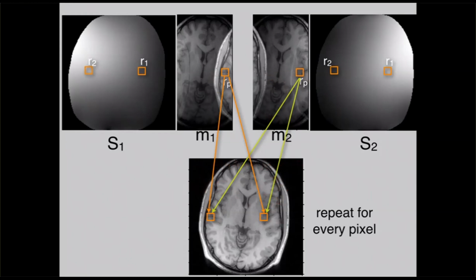Okay. Now, basically, the problem of reconstruction becomes separable for every, in this case, every 2 pixels. We solve 2 pixels at a time, and we shift, and we solve 2 pixels at a time. And here is just a single pixel at a time. So, there's going to be a different matrix for this location, and there's going to be a different matrix for this location, and there's going to be a different matrix for this location.